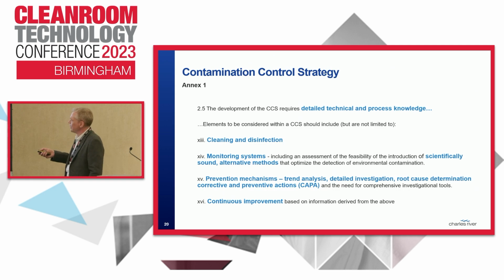But there's also other elements that are listed in here: cleaning and disinfection. It talks about using scientifically sound methods to detect contamination. It talks about prevention mechanisms such as trending, investigations, root cause determination and CAPA, which we saw from the case study.